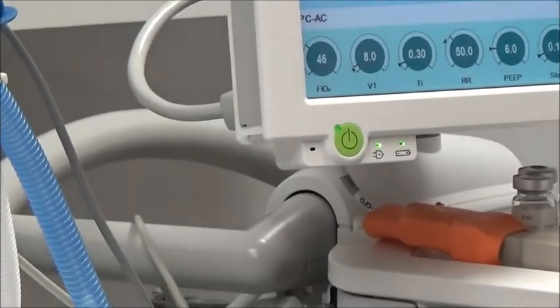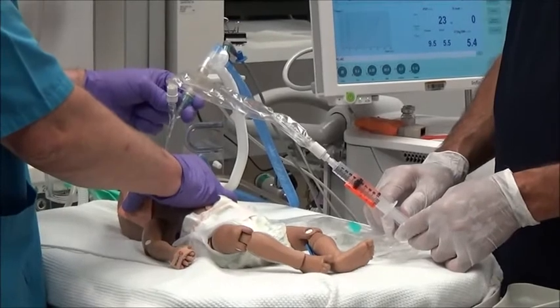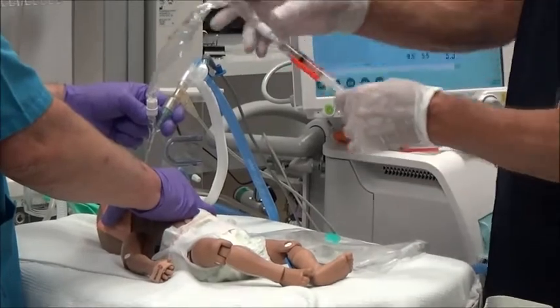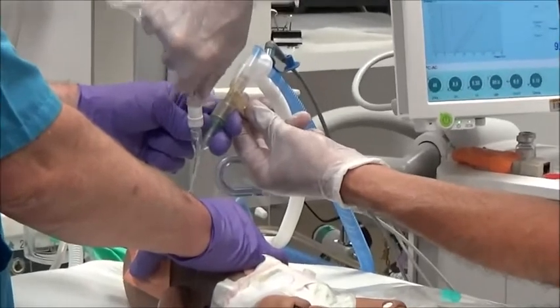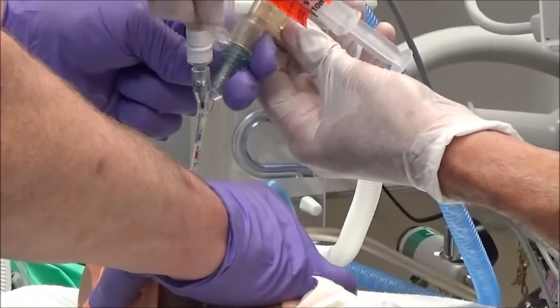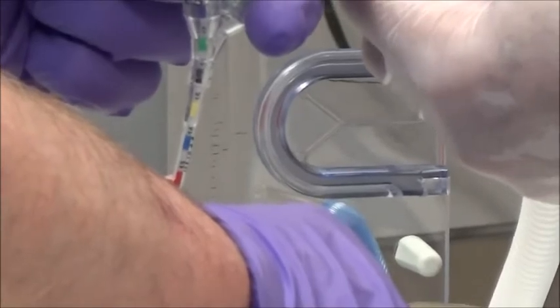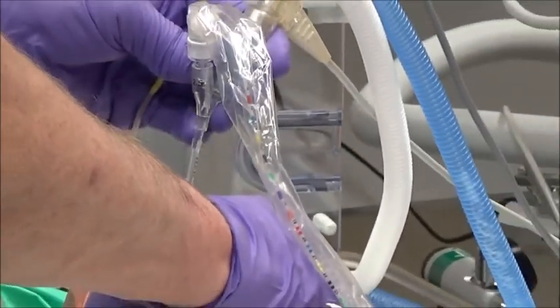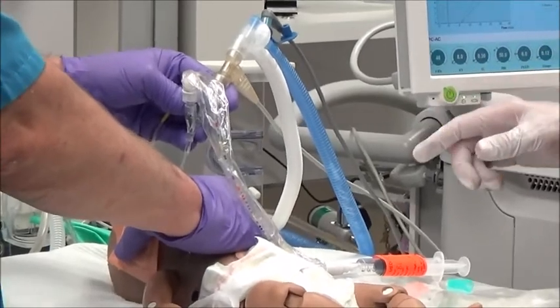Allow a minimum recovery period of 40 to 60 seconds prior to delivery of the next aliquot. For subsequent aliquots, repeat the previous steps to effectively deliver the surfactant dose, ensuring the infant is assessed for oxygenation and ventilation between aliquots. If the infant becomes unstable at any time during the procedure — such as heart rate decreasing to less than 100 beats per minute and/or SpO2 less than 80% — consider emergency measures.